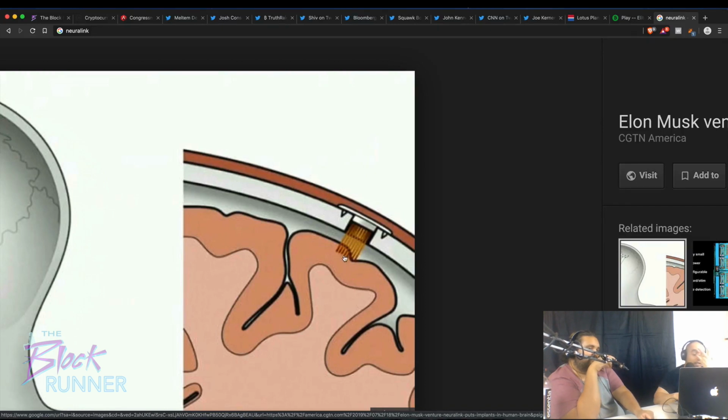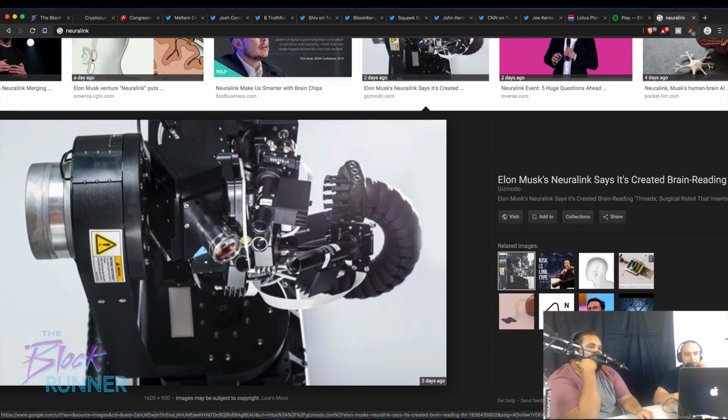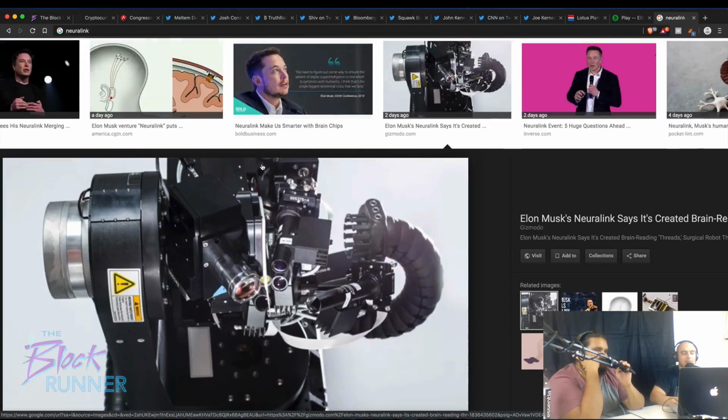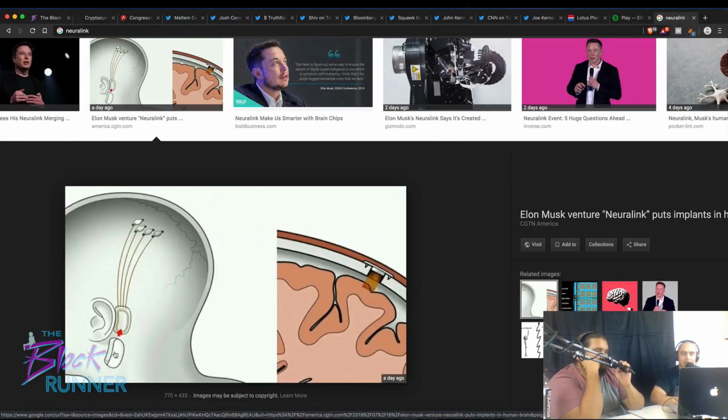The electrodes get implanted into the brain, and there's this tiny little needle. This looks like a huge machine, but this little spike here, this little needle, is what does it accurately. It was interesting because they showed a brain, and it was moving because it's alive, right? There's blood pumping. So what the computer does is anticipate all this movement and accurately pinpoint the location where these electrodes are supposed to go, so you get all these tiny electrodes inserted into your brain via that needle, and then you get access to whatever interface you're trying to access via this device.